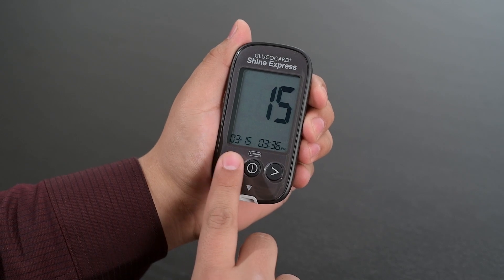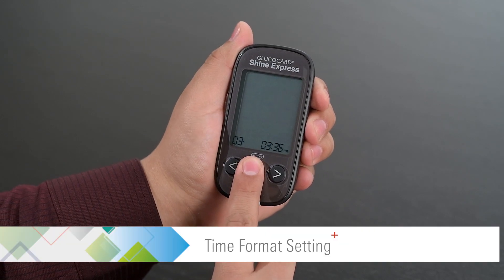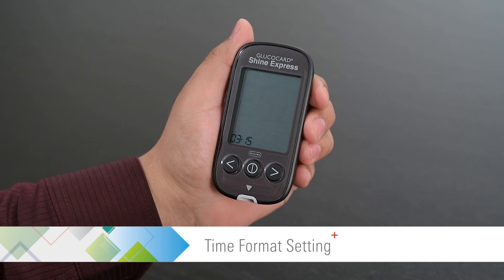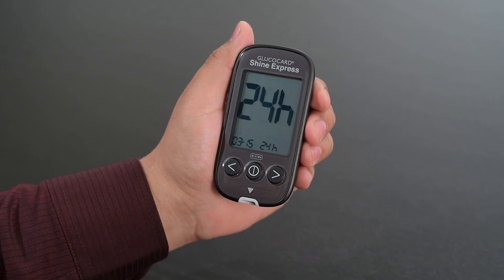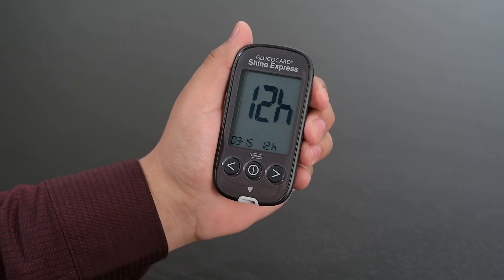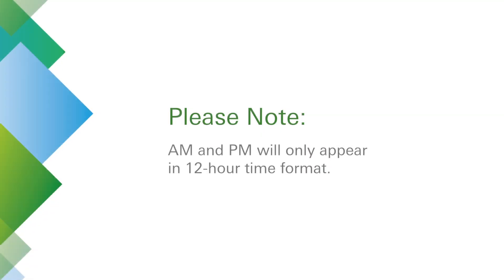Then press the center button to proceed to the time format setting. Use the left or right arrow buttons to select either 12-hour or 24-hour time format. A.M. and P.M. will only appear in 12-hour time format.